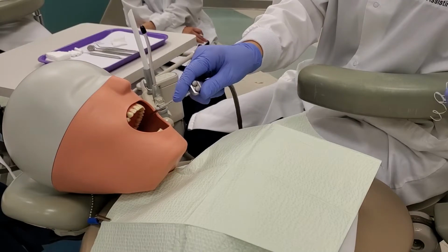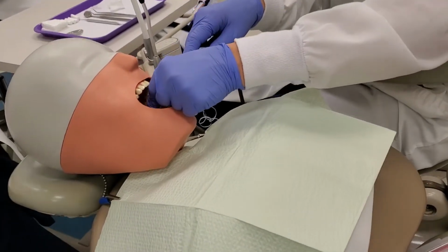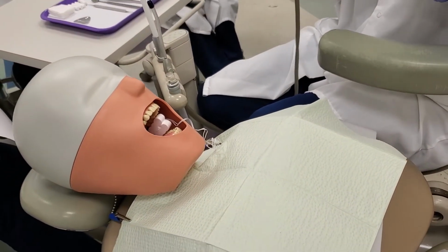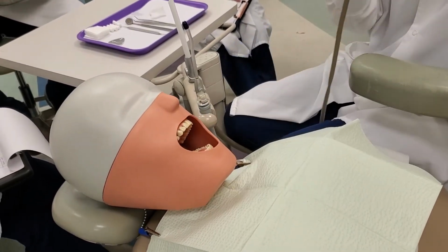If we're going to be placing it on the left side, again, you want to just retract so you can see what you're doing. Place the bite block and then leave it at that. That's it. And then you're going to remove it. Again, you're going to retract, have the patient open, take it out. Okay.